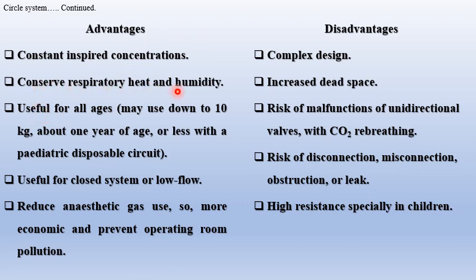Conserves respiratory heat and humidity by production of water and heat during reaction with carbon dioxide, which is valuable for the patient. It is useful for all ages. Useful for closed system and low flow. It helps to reduce anesthetic gas use, so more economic, and prevents operating room pollution.